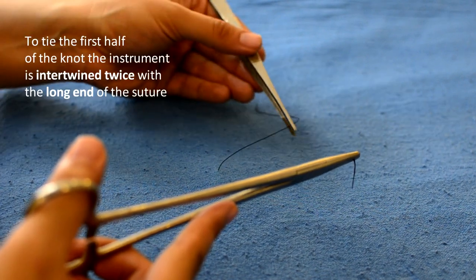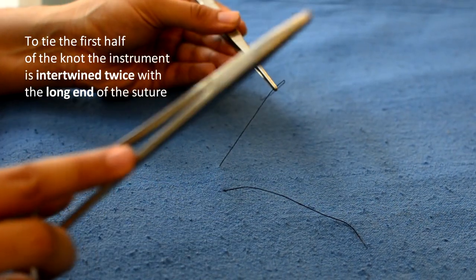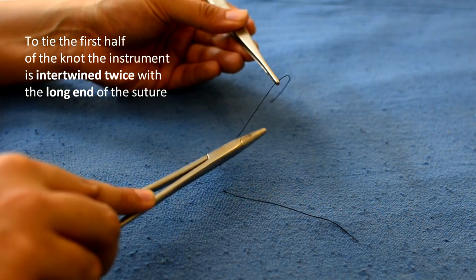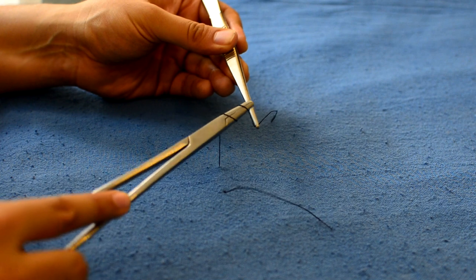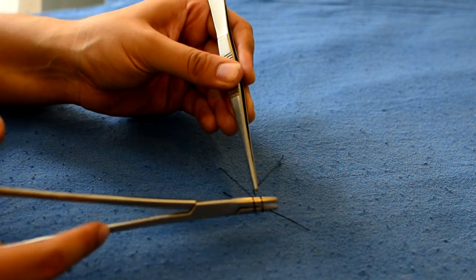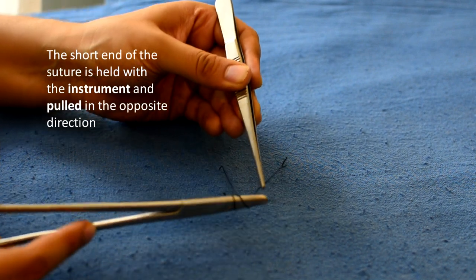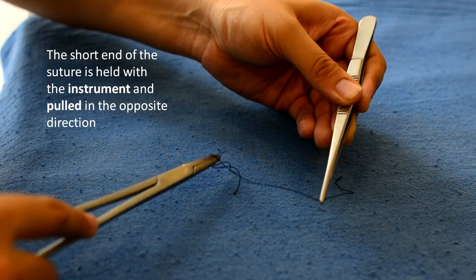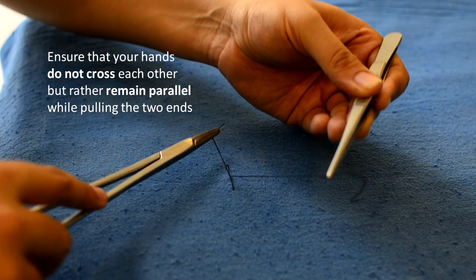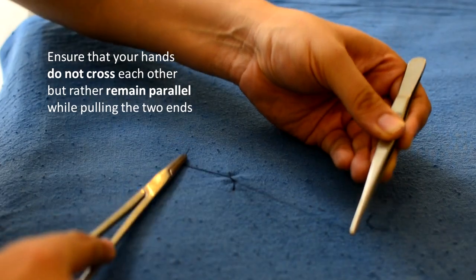To tie the first half of the knot, the instrument is intertwined twice with the long end of the suture. The short end is held by the instrument and they are pulled in the opposite directions. At this point, it must be remembered that the hands should not cross each other. They should rather move in parallel planes.